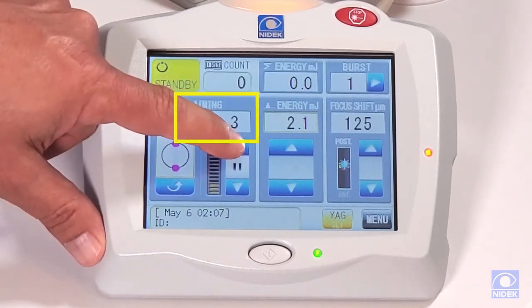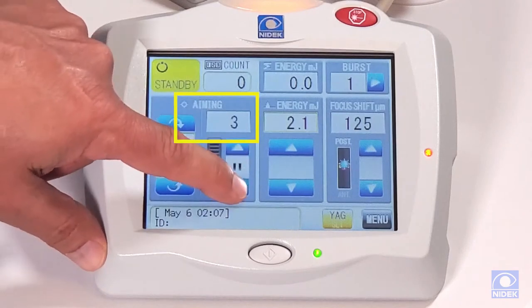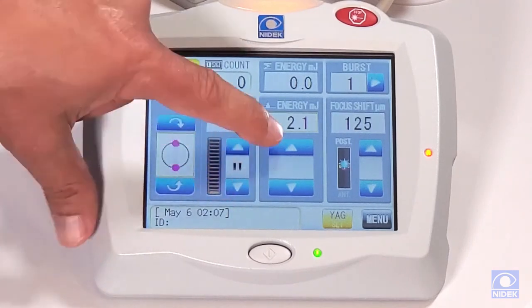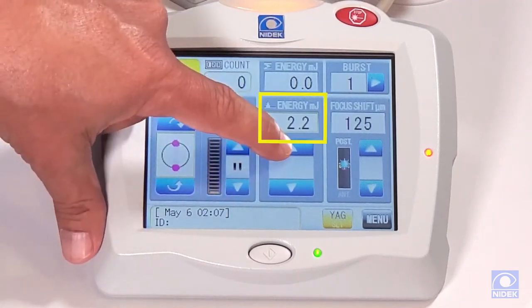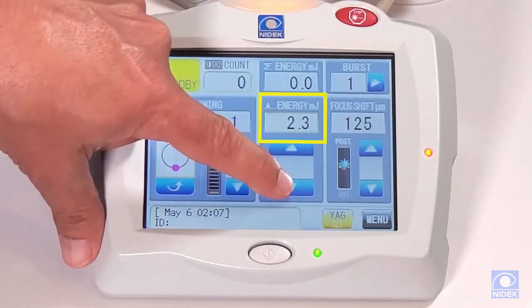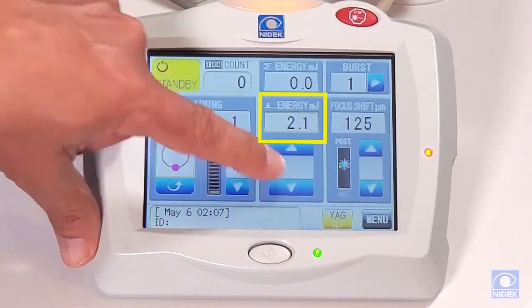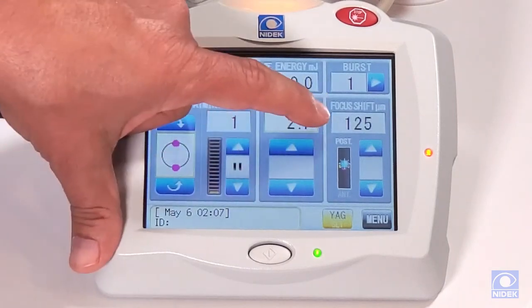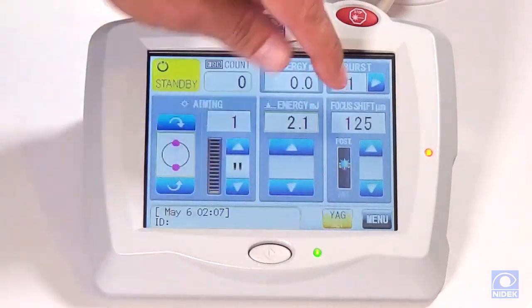Here we can increase and decrease the aiming beam intensity. This is how we increase and decrease our energy output. And we also have our focus shift.